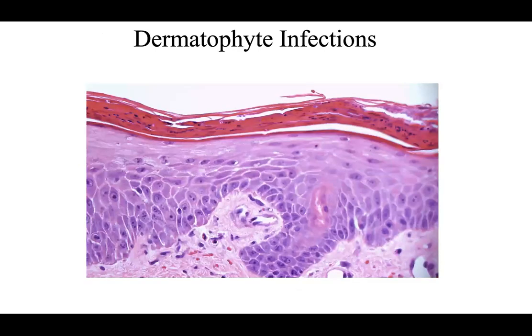Here are more dermatophyte infection examples, just showing you spongiotic dermatitis. You might appreciate these neutrophils in the stratum corneum here and some serum-containing crust. So no one would blame you for not seeing organisms on this, but someone could blame you for not doing a GMS on this, even if the clinician didn't suspect fungus. So when in doubt, do a GMS just to rule in or rule out fungal infection.